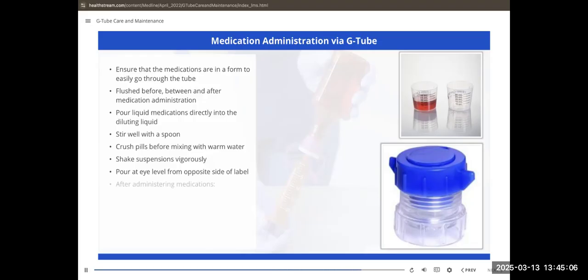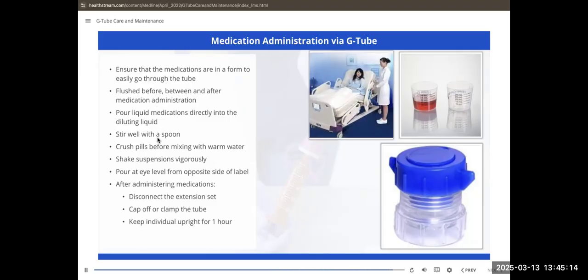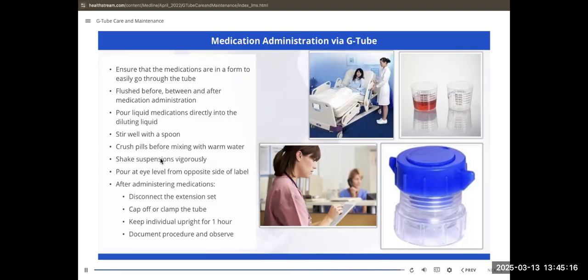After administering medications, disconnect the extension set, cap off or clamp the tube, keep the individual upright for 1 hour, and document the procedure and observe.